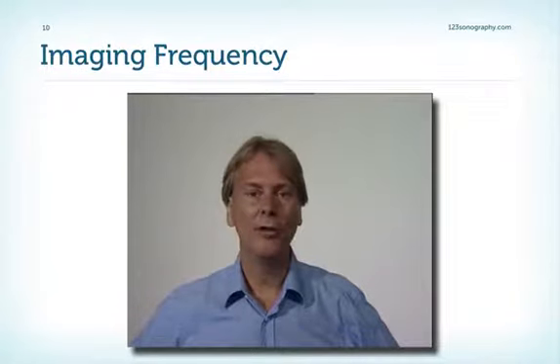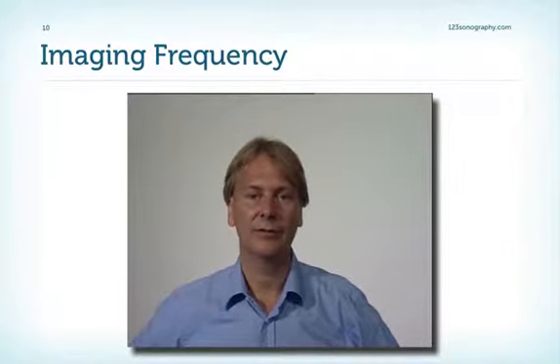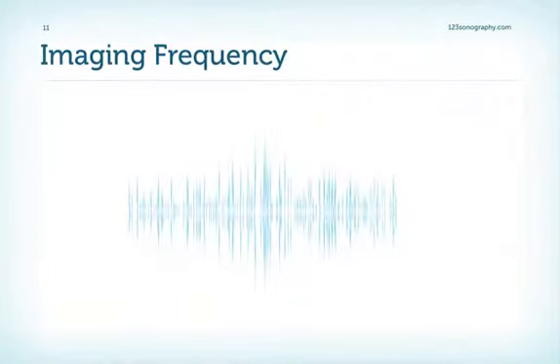In modern imaging transducers, you can change the imaging frequency. And this has a profound impact on the quality of the image. In the following demo, you will see what happens to the image when we change the imaging frequency.